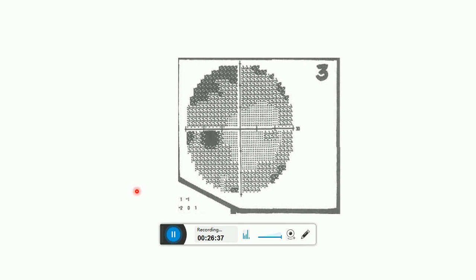Now this is zone 3, the grayscale graph. It's a color-coded representation of the retinal sensitivity of the patient. It is not used for the final interpretation of the field test but is important for patient education. Values closer to 0 dB are illustrated as black points of varying shades, whereas a point close to 50 dB is illustrated as white.